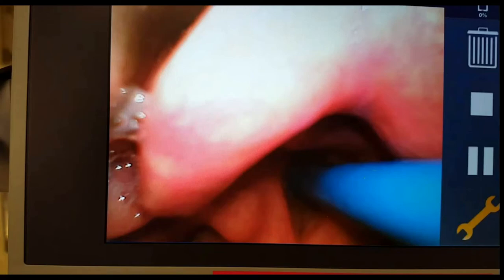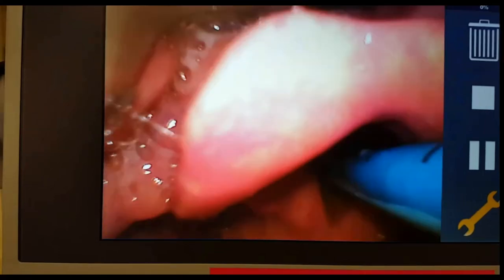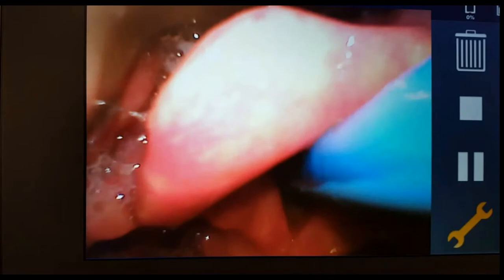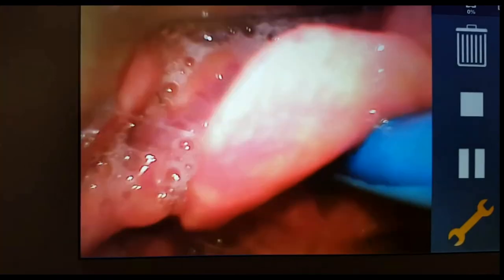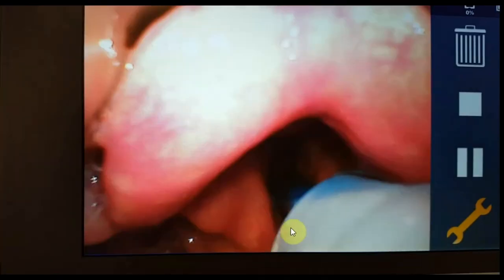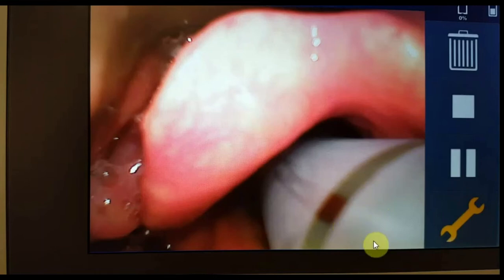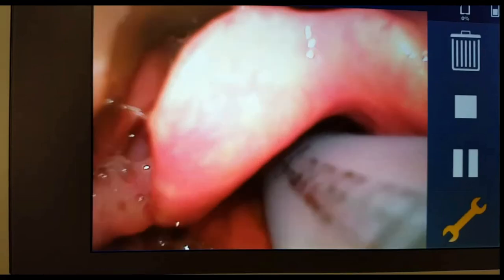After introducing the bougie, under its guidance I then introduce the endotracheal tube. That is the end of the tube, and that is the black depth marker line that we need to keep an eye on. As long as the black line passes through the vocal cords, we can then remove the bougie and secure the tube at this position, and then inflate the cuff.